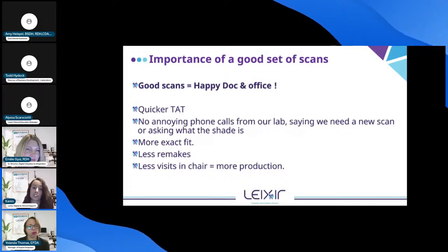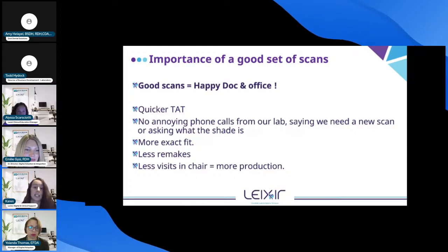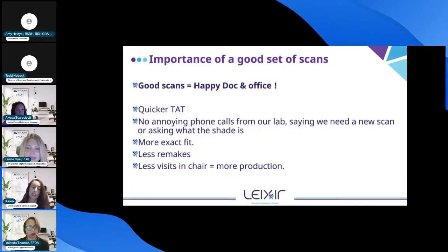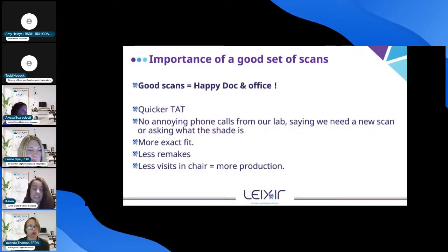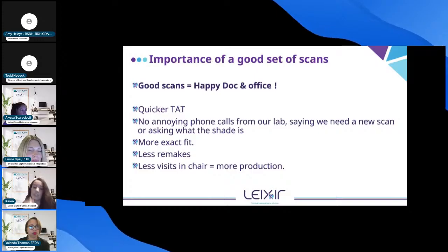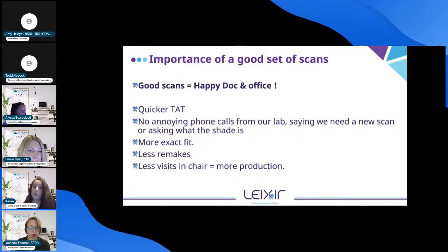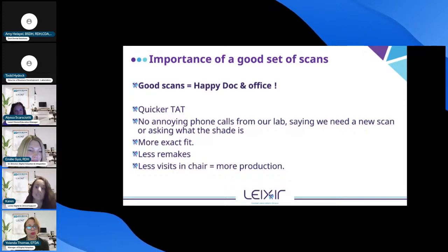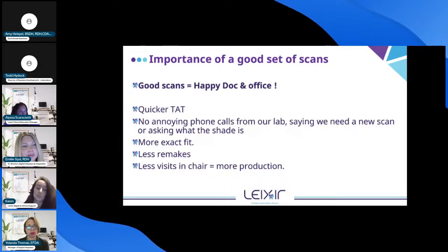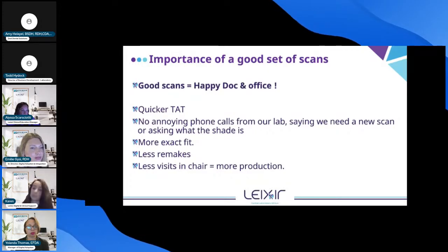Fewer remakes. How does a good scan lead to fewer remakes? Well, you guys might send the scan and think it's great. We look at it and it works. But then the day comes for the insert of the denture and you're not hearing that suction on an upper palate. Probably because the scan wasn't the greatest and we just did what we needed to do to get by, which isn't what we want to do, but we can't call every single person every single time something's not perfect on a scan. So aiming for perfection when scanning before you send it to us makes everyone's life easier.